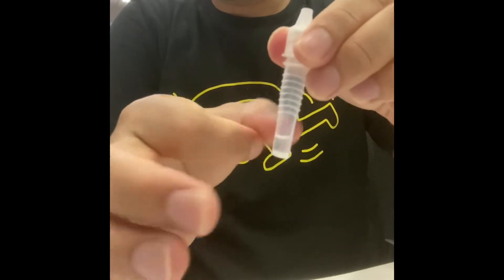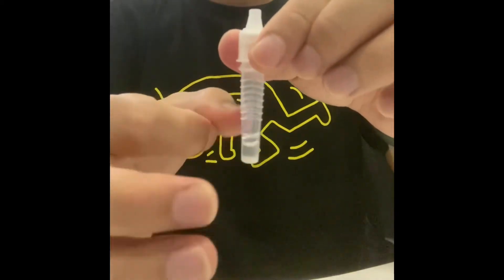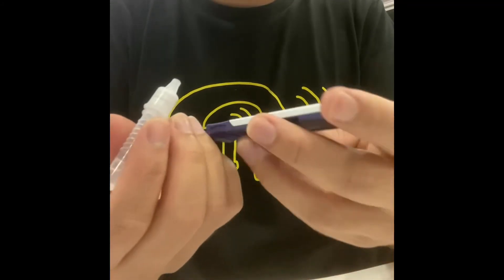Be careful, don't be too loose. Then use your finger to gently tap the side of the tube a few times to mix it well inside.